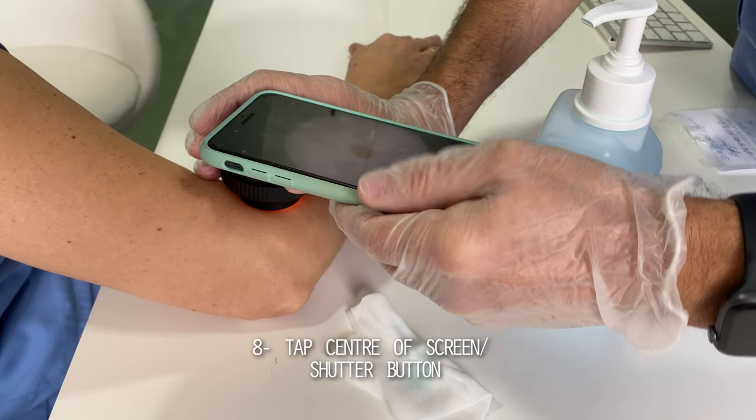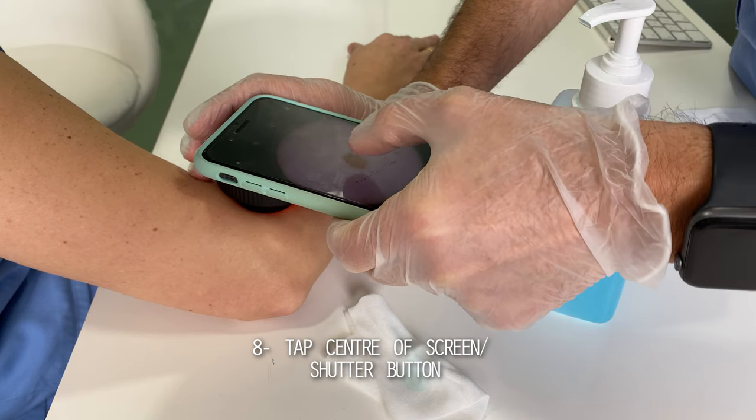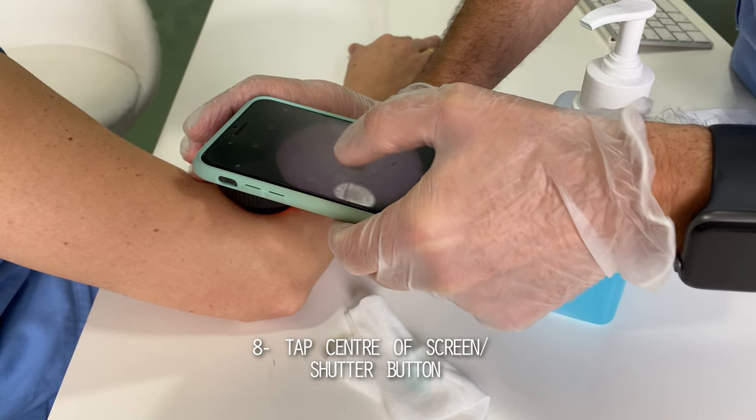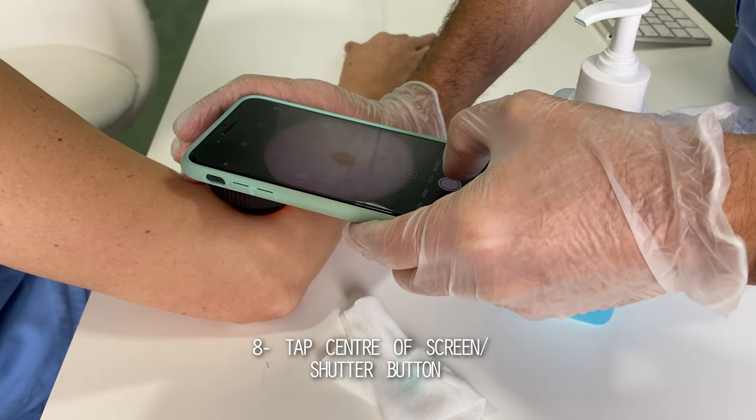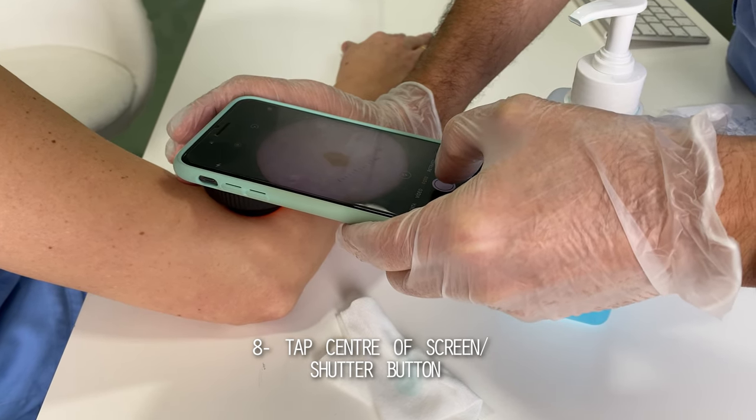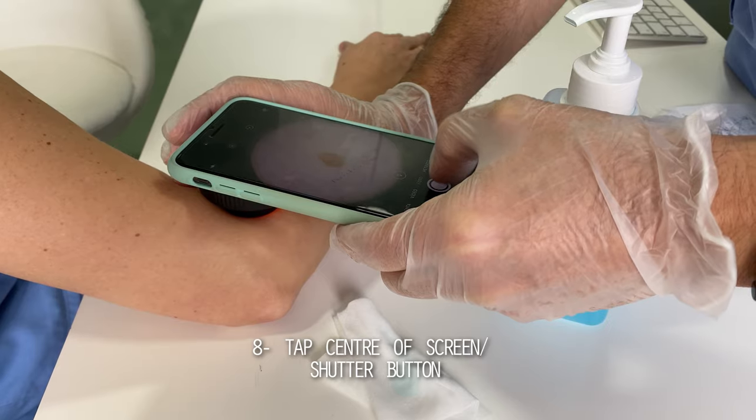Once all previous things are sorted out, you want to tap the center of the screen of your mobile device so that the autofocus gets engaged and our target appears sharp and well defined. Finally, press the shutter button to take the picture.